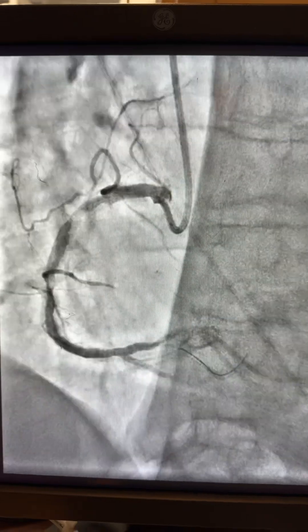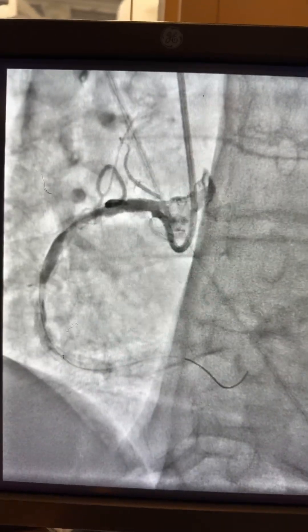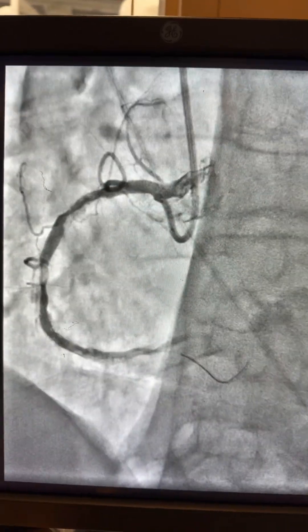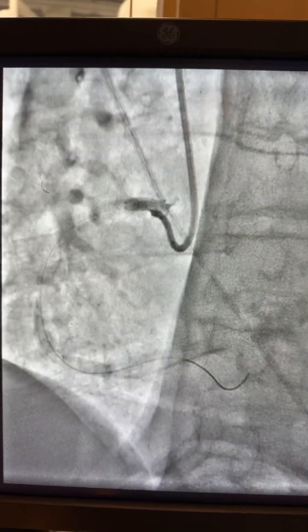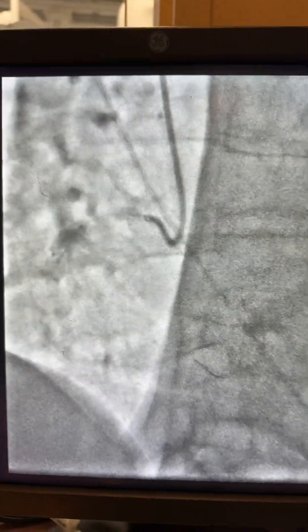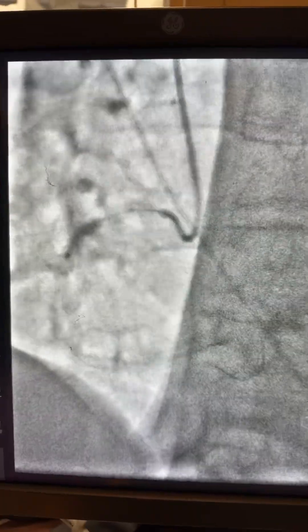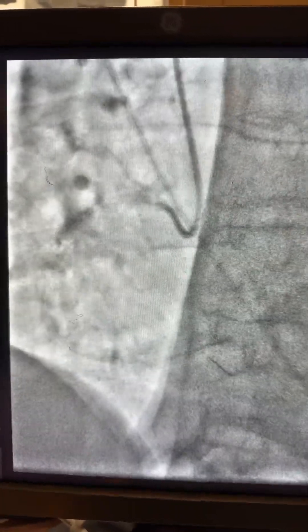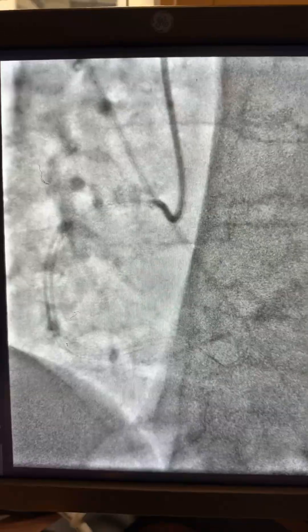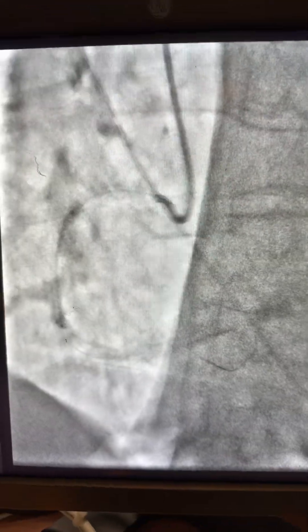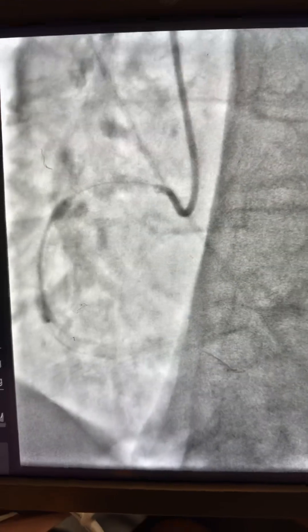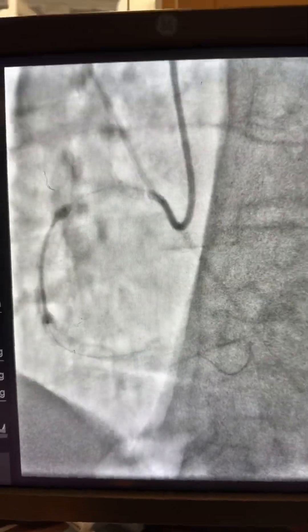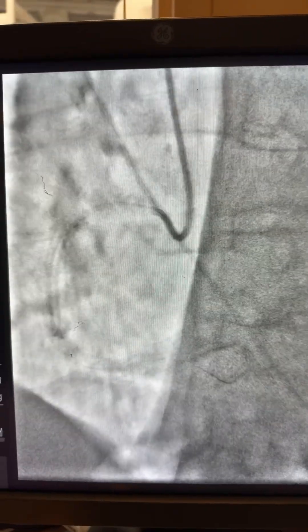Here is the lesion after the lithotripsy — it's a very nasty and calcified, unstable plaque. I then did more shock wave runs.